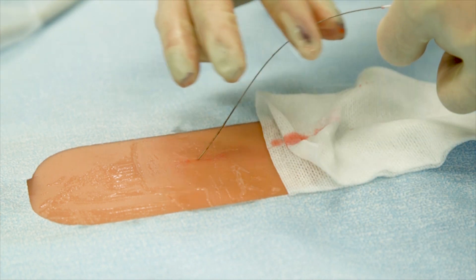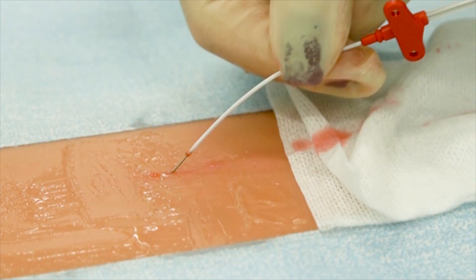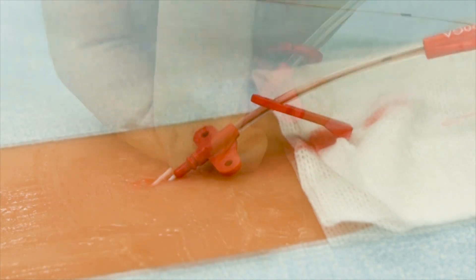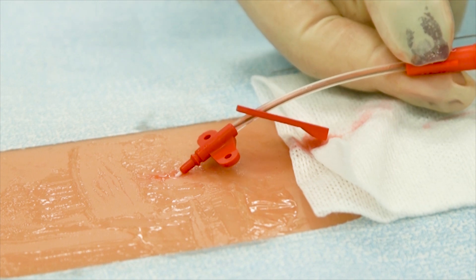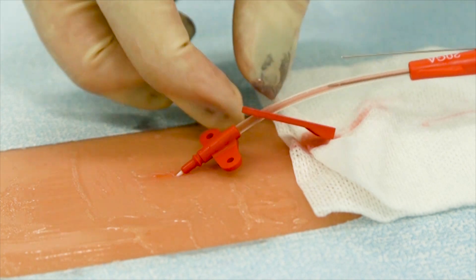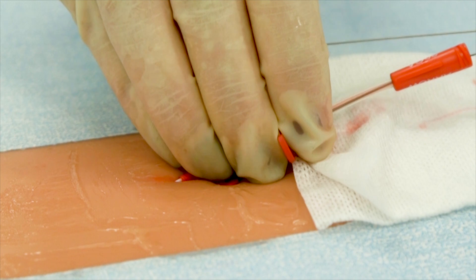Advance the catheter forward over the wire guide. Once the wire has exited the extension line, grasp the wire and continue to advance the catheter into position. Hold the catheter in place and remove the spring wire guide assembly. A pulsatile blood flow should be visible at the end of the catheter — this is a positive arterial placement. Clamp the lumen with the slide clamp.